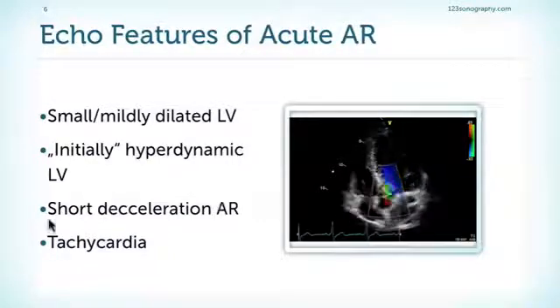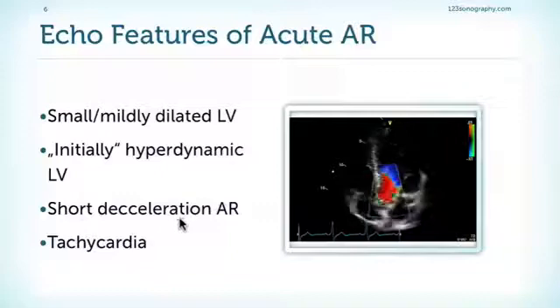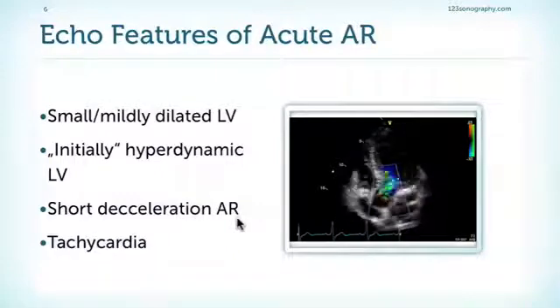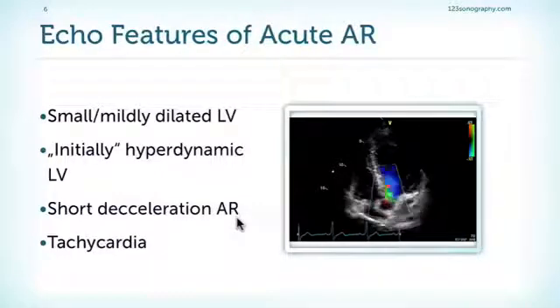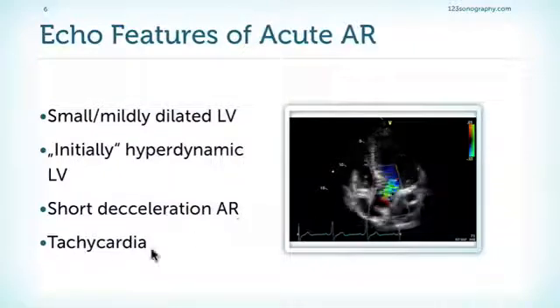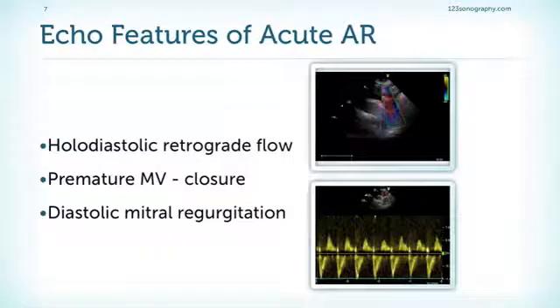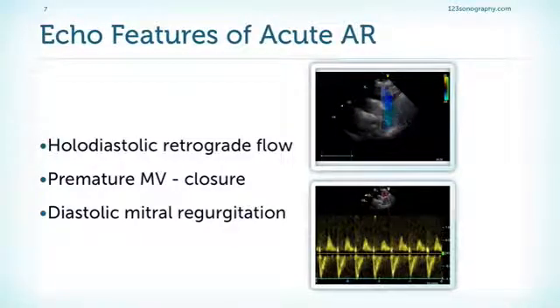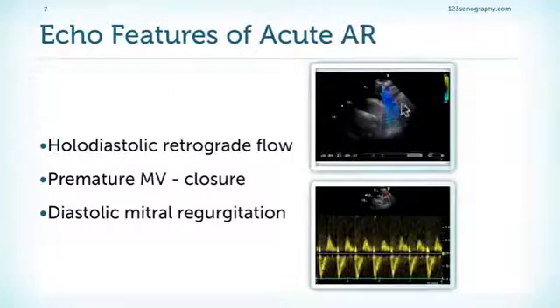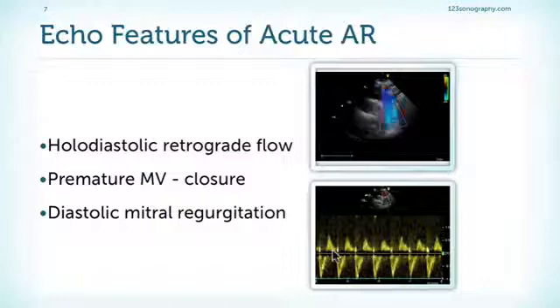A very typical finding is a very short deceleration time of the continuous wave Doppler spectrum of aortic regurgitation. I already mentioned tachycardia. Another finding we frequently see is holodiastolic retrograde flow, just as we see in chronic aortic regurgitation. This is such an example, here in color Doppler and here with the pulse wave Doppler — holodiastolic flow.